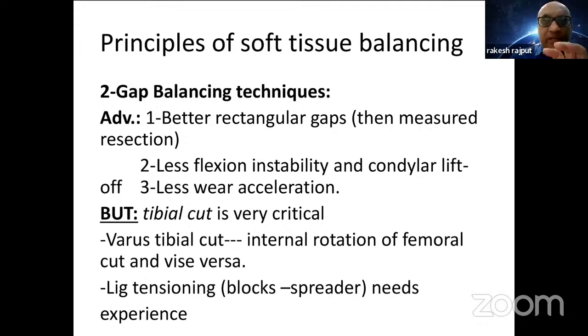And in this technique, it doesn't really matter how much femur you're rotating. Occasionally you can even get an internal rotation on the femur, but because your gaps are so well balanced, the patella still will track. And this is the same philosophy which the robotic surgeons have also taken over. Sometimes they rotate the femur internally by one or occasionally by 2 degrees.